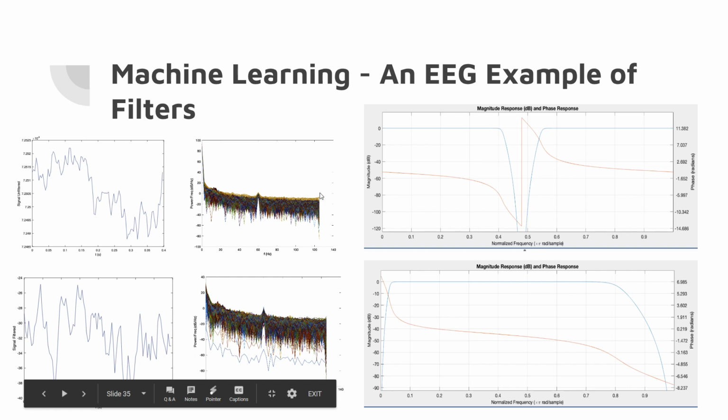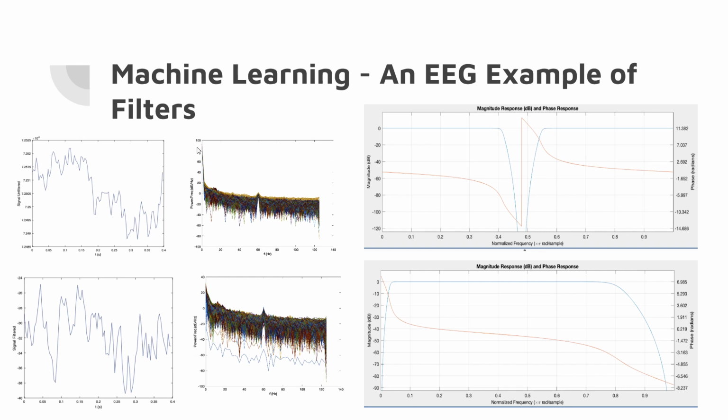And you can even see that in the frequency spectrum, which still has mostly the same spikes, but you can see that the magnitude of the DC component and this lower frequency range, around 3 hertz, which is pretty common for blinks, for blink artifacts, was around 100 decibels. But if you go down here, now it's like 30 decibels. This has been significantly reduced comparatively.